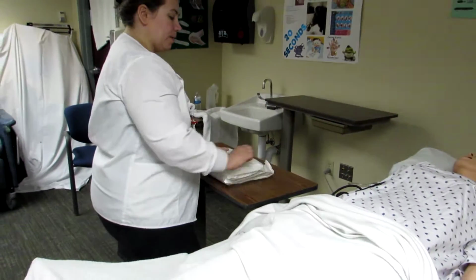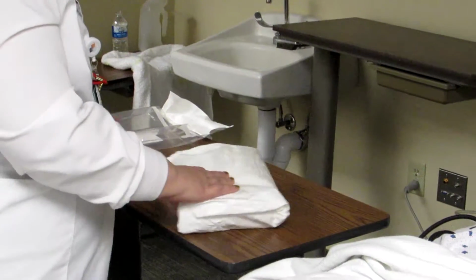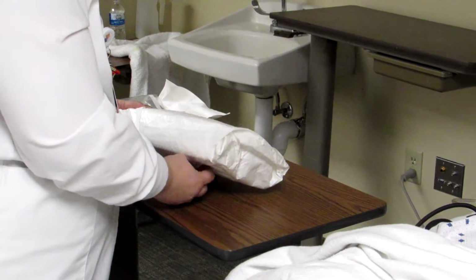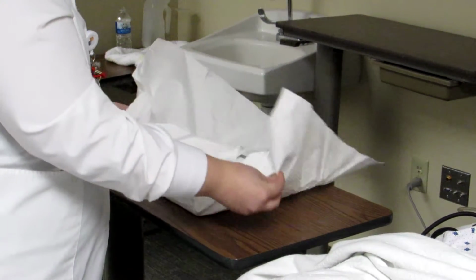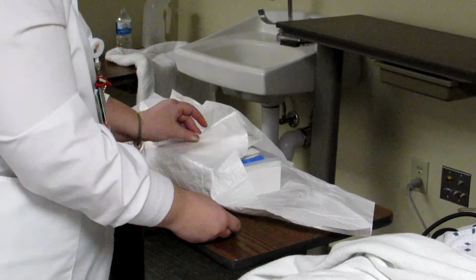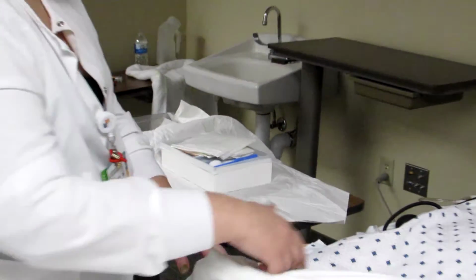So again, I'm going to open my kit. I'm going to pull the kit out, okay? I'm going to open it away from me, grab from underneath, and open my kit. We need to get her perineal area set up.